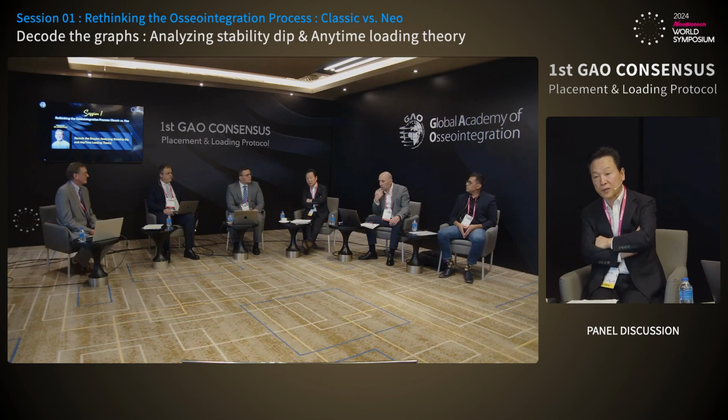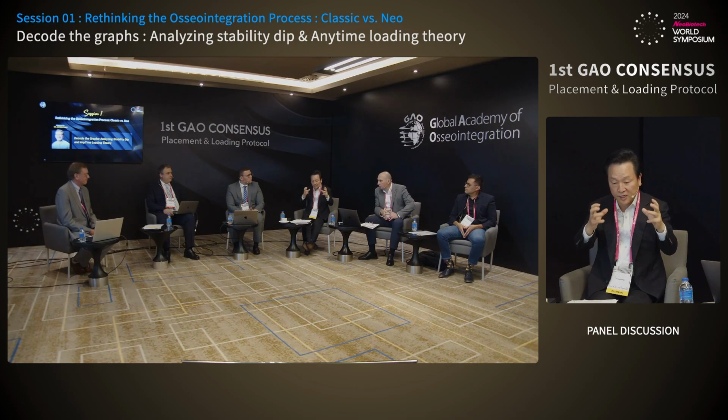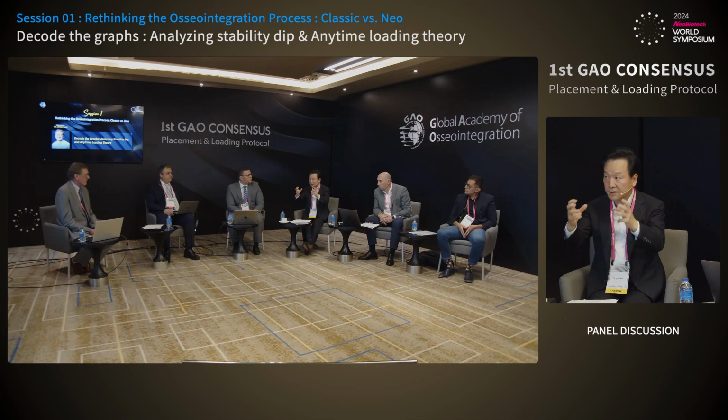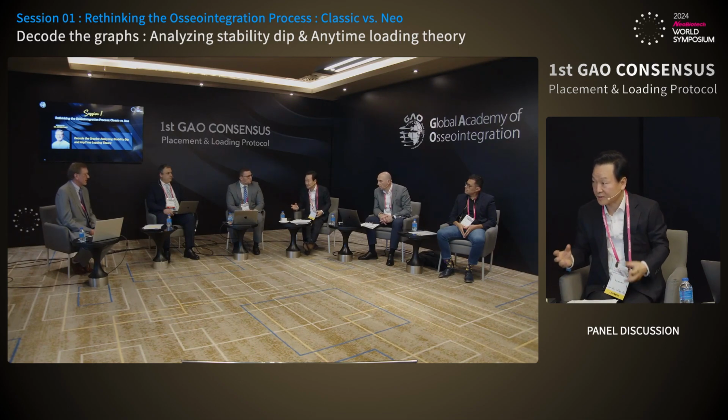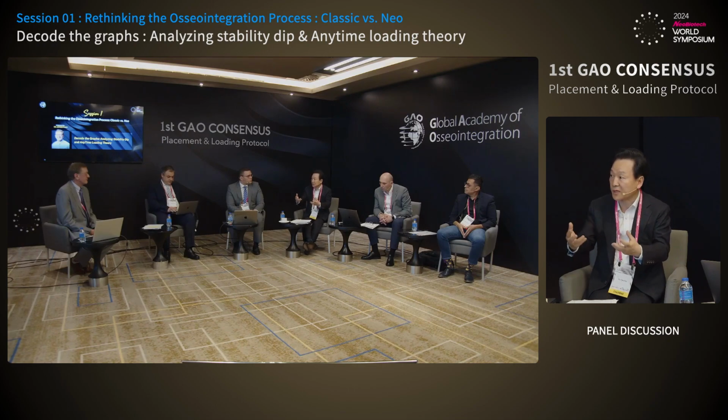Because we know that an implant can have a stability dip, as you show, right? Even though we get a good fixation, after 1 week, 2 weeks, the implant gets loose, gets weaker, right? Yes. So we know that, so we want to wait. But today, we want to overcome this phenomenon, right? We want to eliminate and minimize the stability dip. So if we can eliminate the stability dip, and then we get the 40 Newton centimeters, everybody can do loading anytime, right? So that's the main idea.